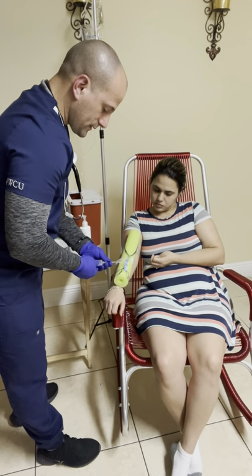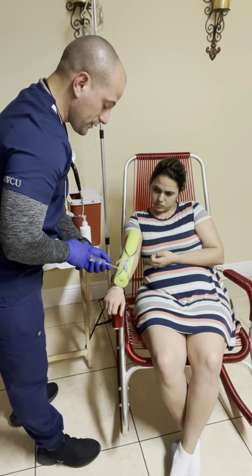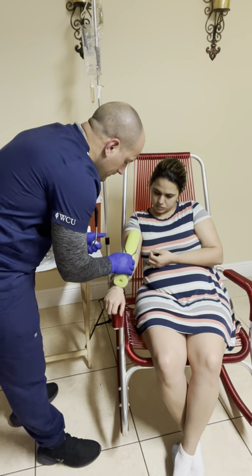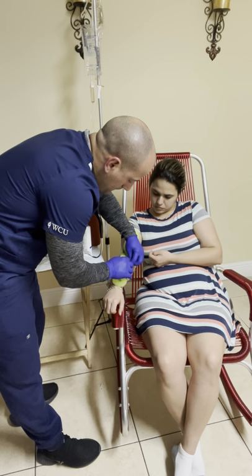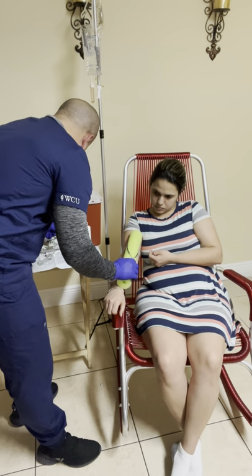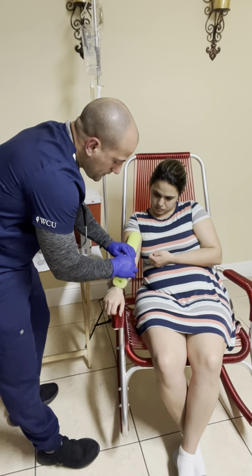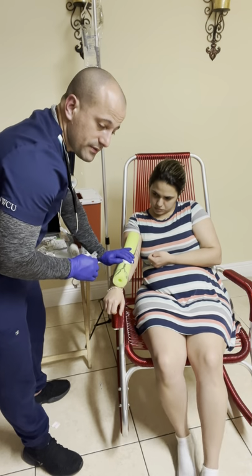I'm going to infuse 20 mL of sodium chloride in the vein. Perfect. Now I'm going to take off the tape. Gently. With the gauze near, at the same time, and with the catheter in parallel position to the arm, I'm going to take off the catheter and push down for at least 30 seconds.